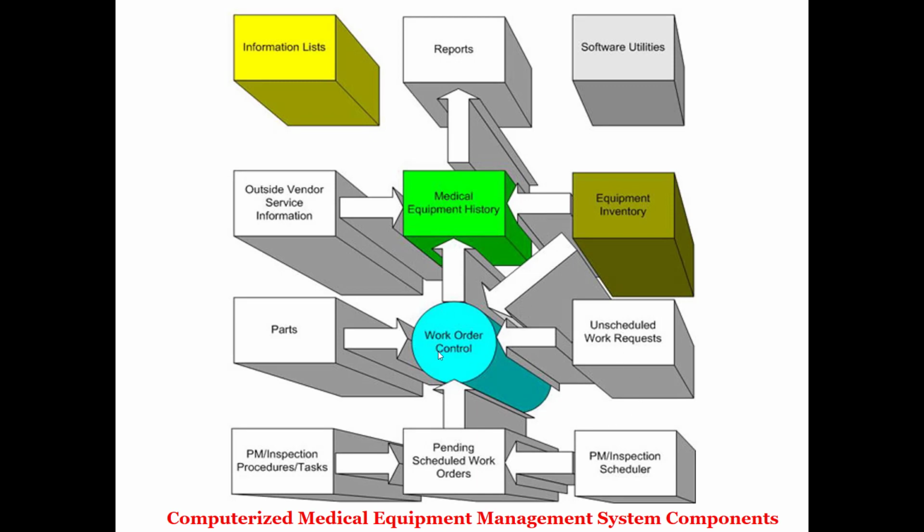Firstly, we have two types of maintenance. We have in-house maintenance, or hospital clinical engineering services inside the hospital, and we have out-house services, or vendor services.